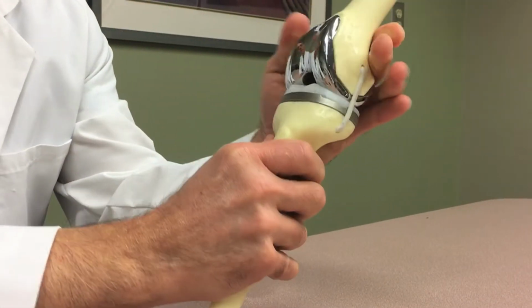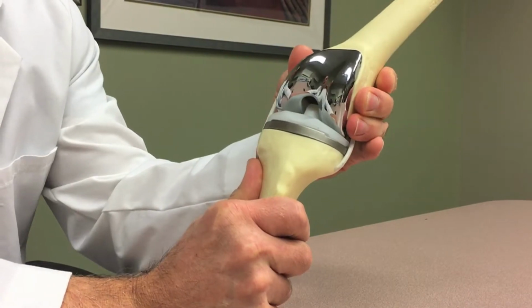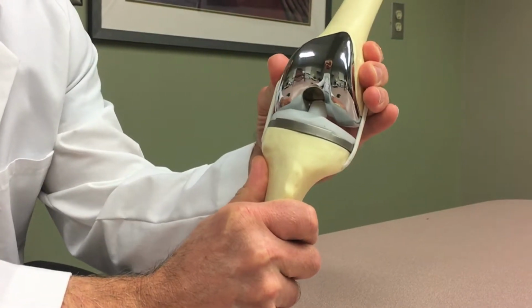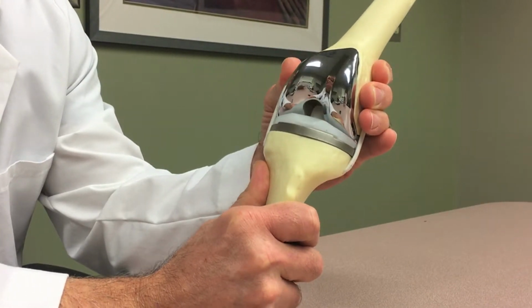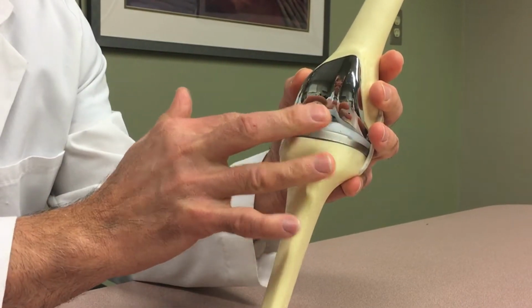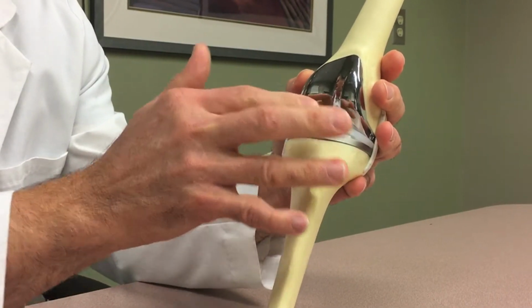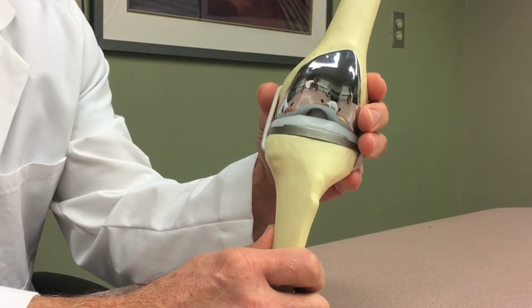Now, what computer navigation does in a knee replacement is you want what we call anatomic alignment, or a straight leg, because if I leave you bow-legged or knock-kneed, you're going to put more pressure on one side of the plastic, and it's going to wear out prematurely. The goal is to get a straight leg, so when you bear weight on that plastic, it's distributed evenly across the entire plastic, and it's going to last 15 to 20 years.